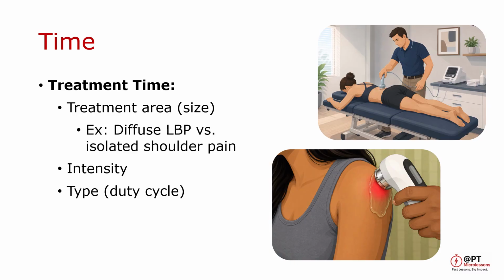Now let's talk about treatment time. This is where things start to come together. Treatment time depends on several key factors, specifically the treatment area, the intensity, and the duty cycle. If the treatment area is larger, the sound energy is spread over a larger region, so less energy reaches any given point, which means more time is required.